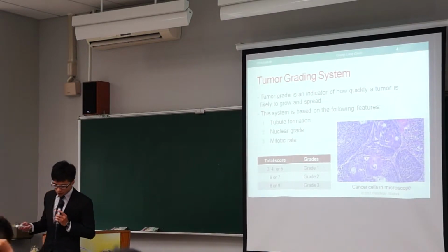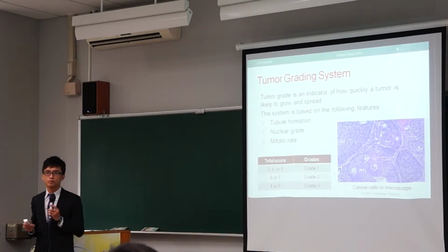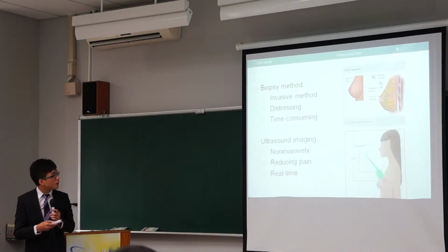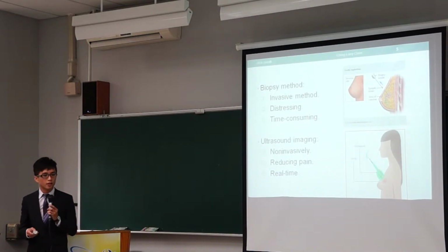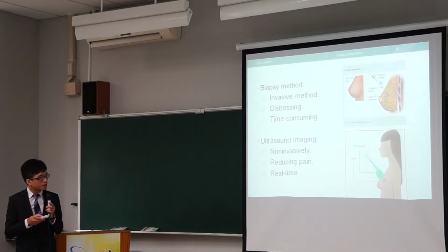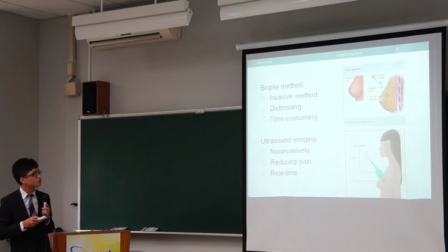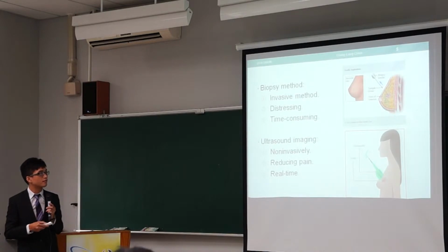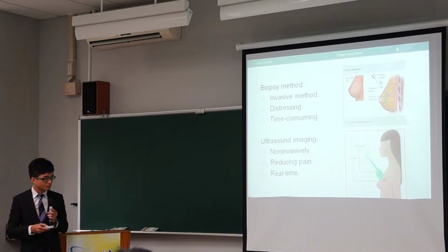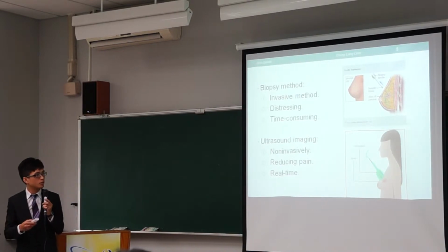But there is a question: how to obtain the cancer cells from the patient's breast? In the traditional way, the doctor uses the biopsy method to obtain the cancer cells. This method is inserting a needle into the breast, like this picture. But this method is invasive and distressing for patients, and it is time-consuming to get a report about tumor grade.